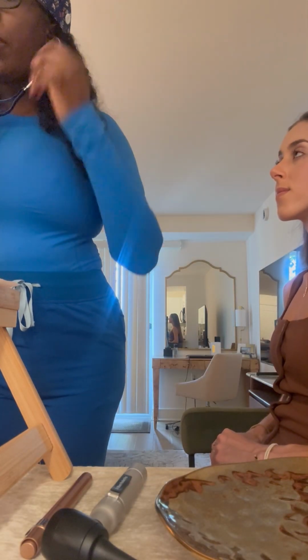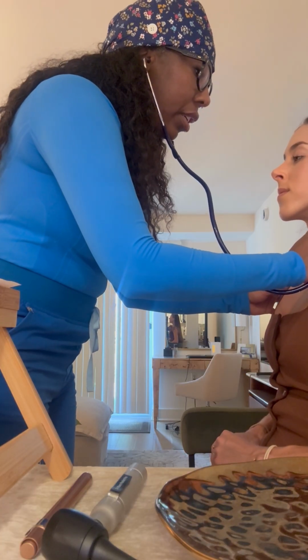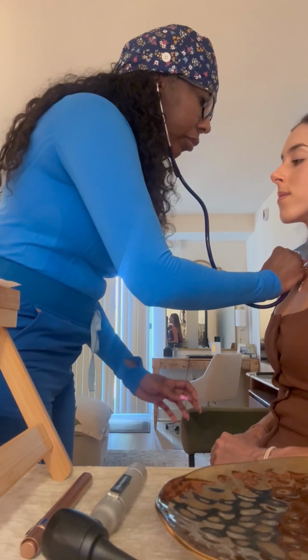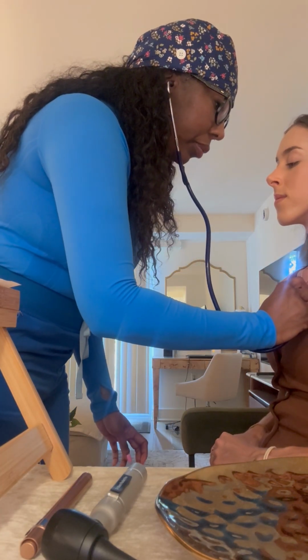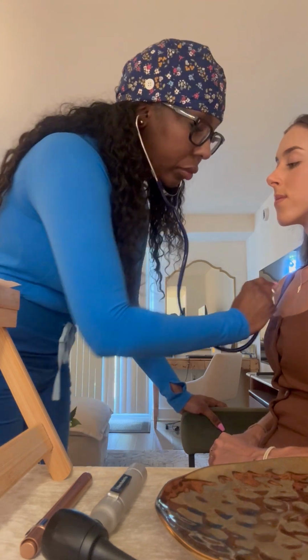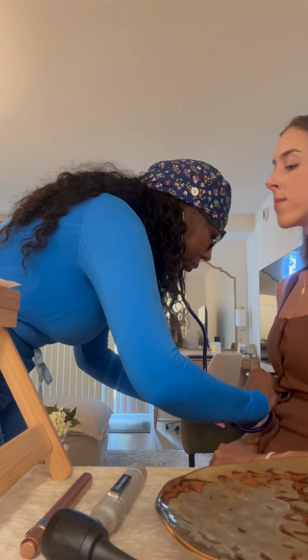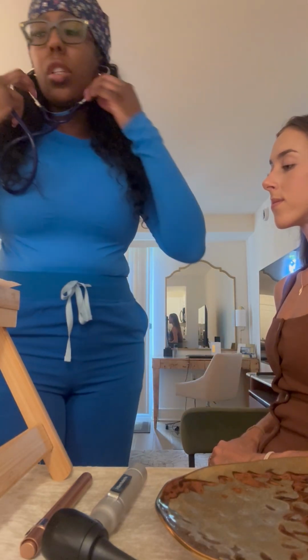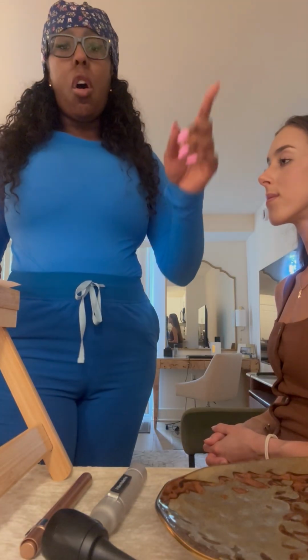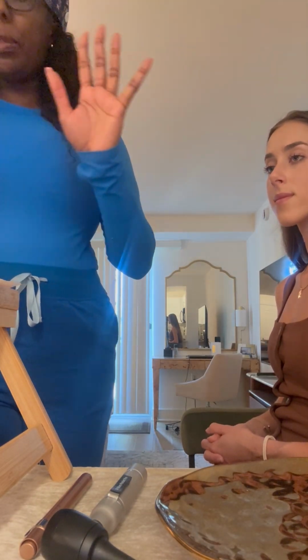Okay, when I auscultate, I'm going to have you take deep breaths, okay? Take a deep breath in. Deep breath in. Now, it's also important when you're assessing the lungs, you're going to go in an S-shaped pattern, also going from left to right so that you can compare each lobe space.